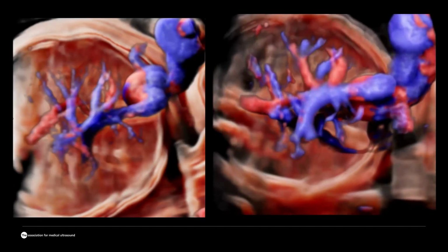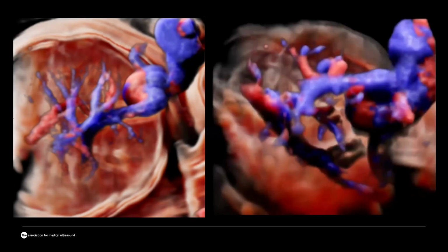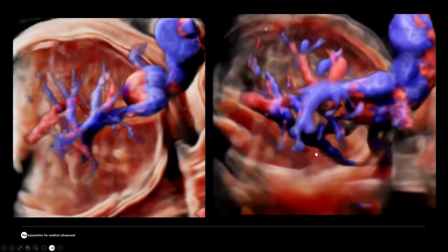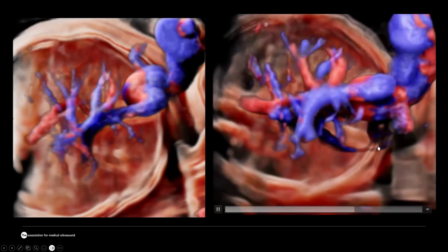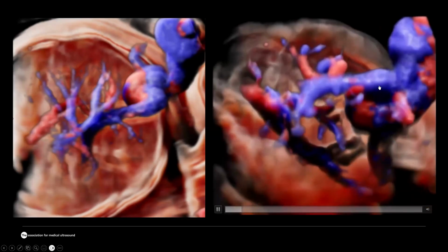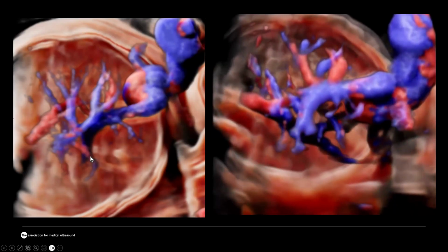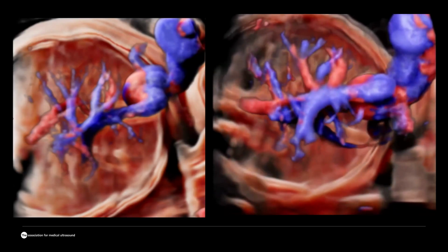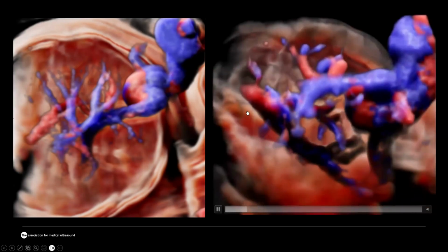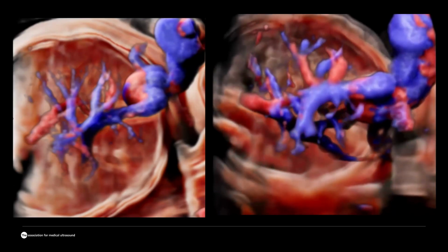And here you can see how 3D ultrasound can help to solve this mystery. We were able to diagnose an umbilical vein varix. And also I would like to demonstrate here, you can see the umbilical arteries, you can see the umbilical vein, you can see the varix, you can reconstruct all the structures related to the abdominal vasculature on that fetus. You can highlight for the patient where the aorta is, and that the bulge really has nothing to do with the fetal aorta.